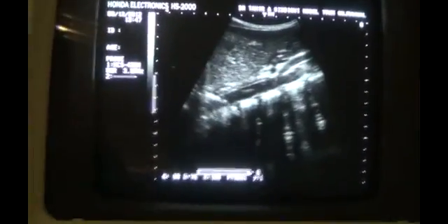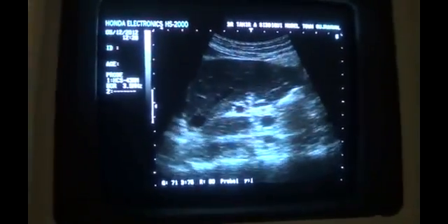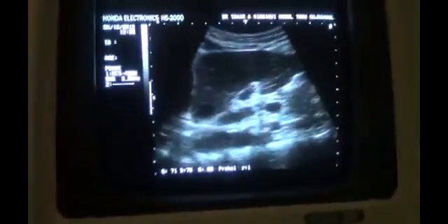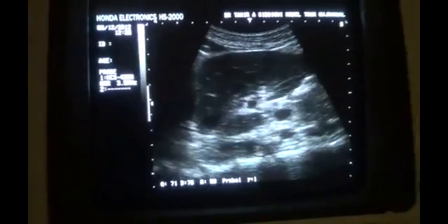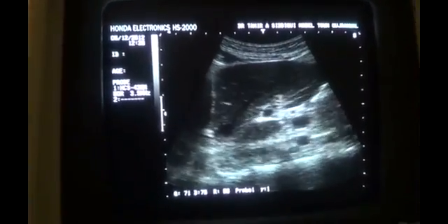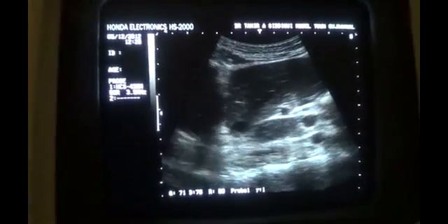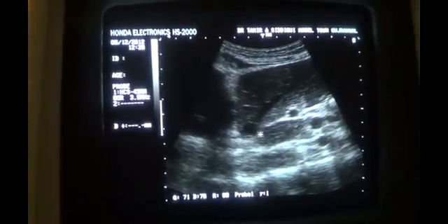Thank you. Now this video segment is in fact to inform you about a pitfall, to be cautious of one mistake that can be made if you don't know the normal properly or are not good in proper ultrasound anatomy. You see, there is a well-demarcated hypoechoic area seen in this angle, and it appears to be a lymph node.